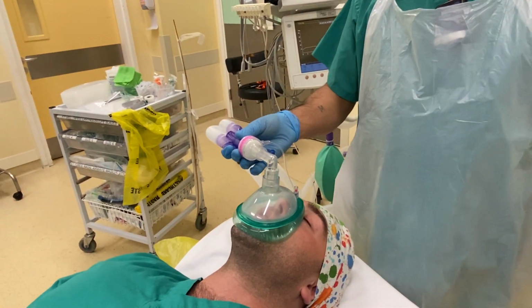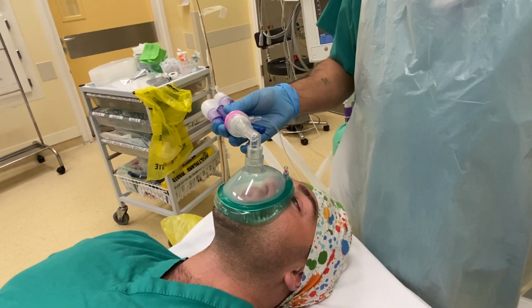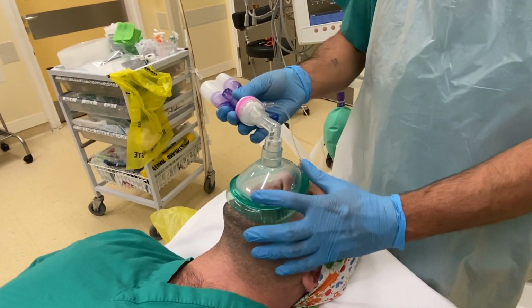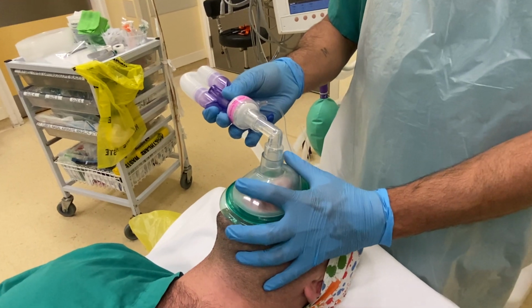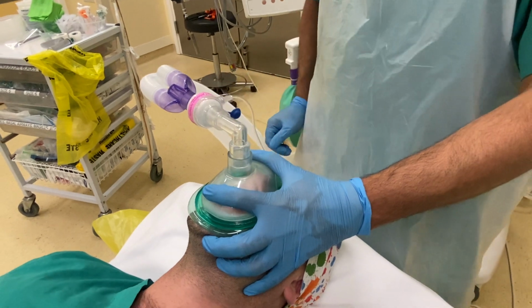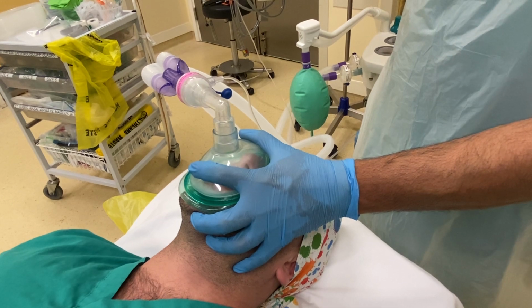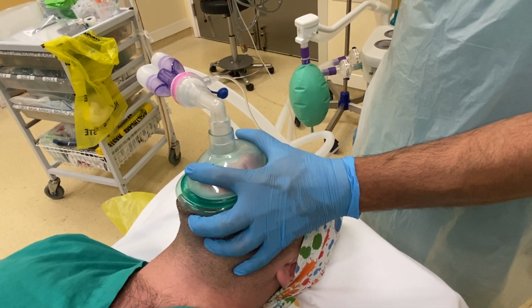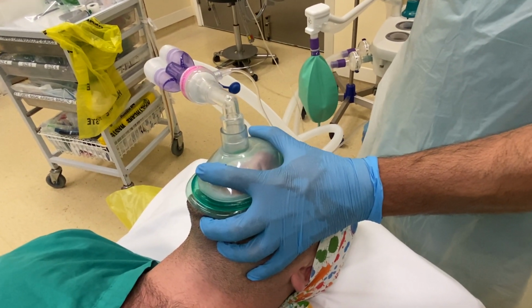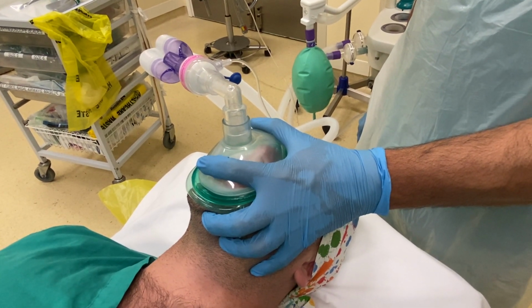So if you have difficulty getting a seal in this way, say if somebody has different facial anatomy, if they have no teeth, or if they're quite large, there's another way that we can hold the mask, and this is a gentle C grip. So you'll see it, that's Kumar's thumb and index finger, so he's going to do that on both sides of the mask, just very, very gently. He's not putting pressure underneath Irla's neck here at all. What he's doing is that using his thumb and index finger, he can manipulate the mask around Irla's nose, around the edge of his mouth, and around his chin to get that seal that he needs. So that's another way of holding a mask.